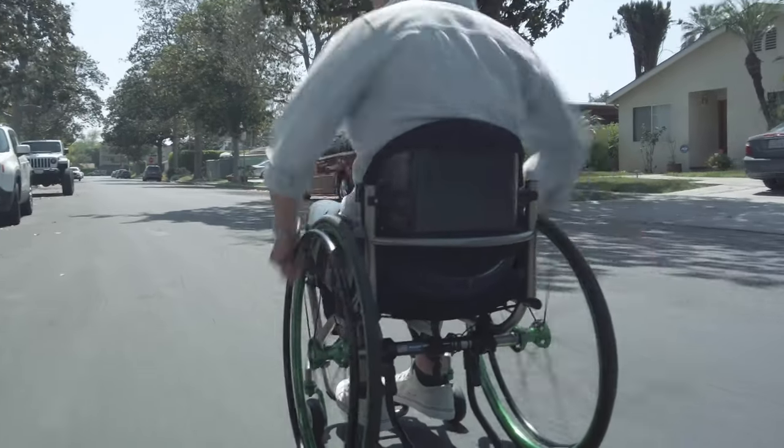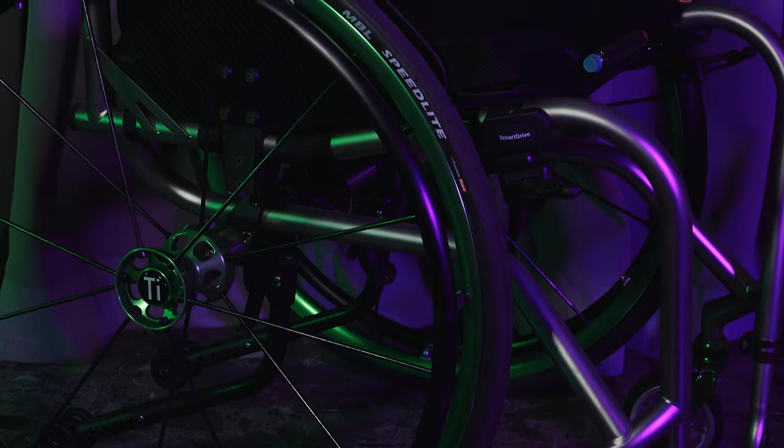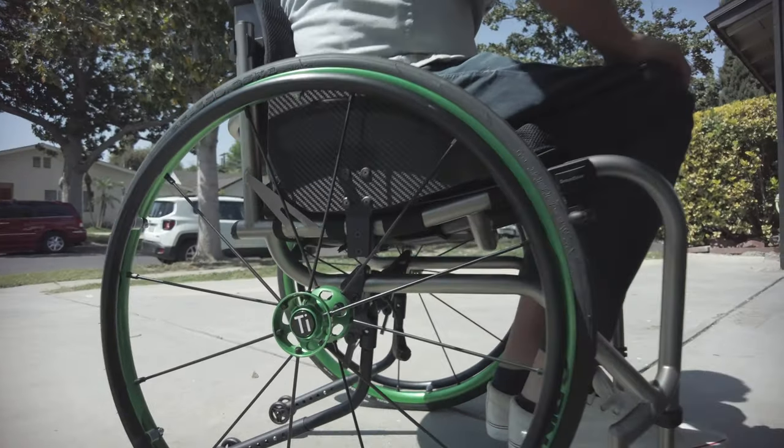The Ti-Lite Ti-R is made of titanium dual tube, so it's great for looks and for performance. It was lightweight and easy to maneuver. Ti-Lite has an awesome option called tattooed finishes — not stickers, but tattooed imprints on the chair's finish.